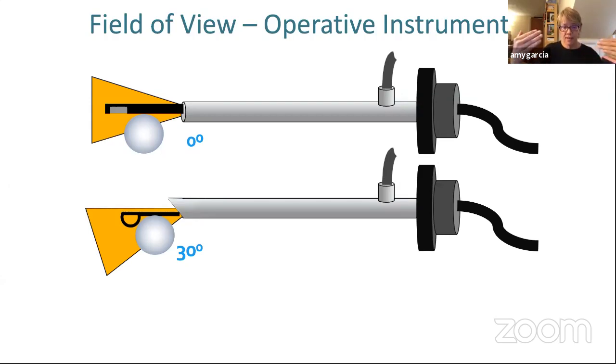And the reason they use a 0-degree lens is that it's hard to get an offset oblique lens angle with the hysteroscopes that have an offset eyepiece. And so there's a 0-degree lens at the tip, the instrument comes into the back. So these instruments are fine and you can actually see your instrument very well. It's just within a more narrow visual field compared to using a 30-degree lens. The light post is up, the lens is looking down, but this is an indicator that the lens will always be looking at the operative instrument.